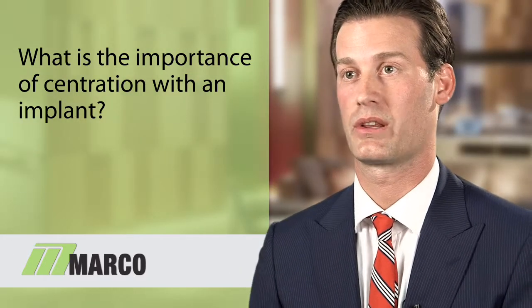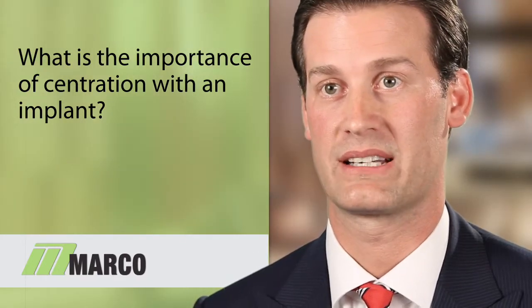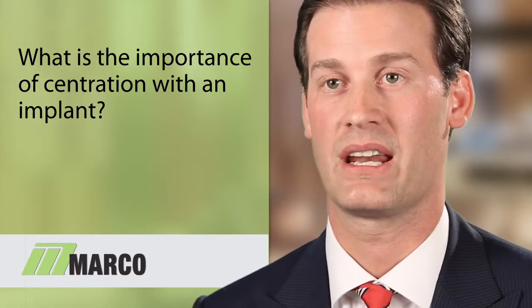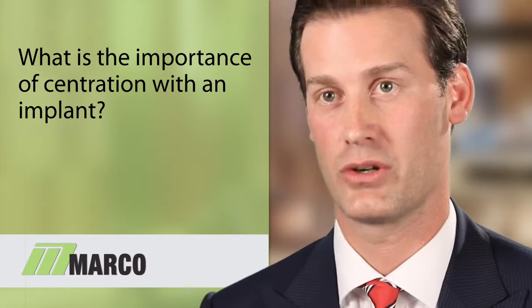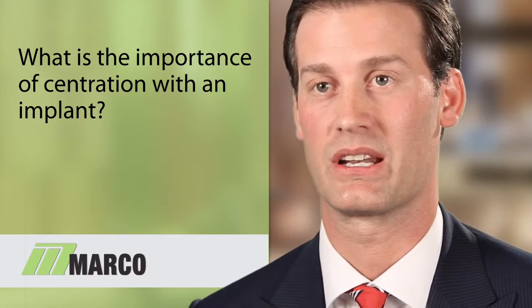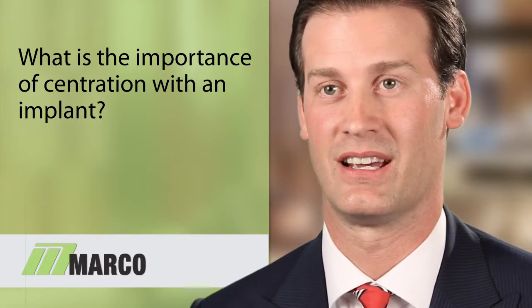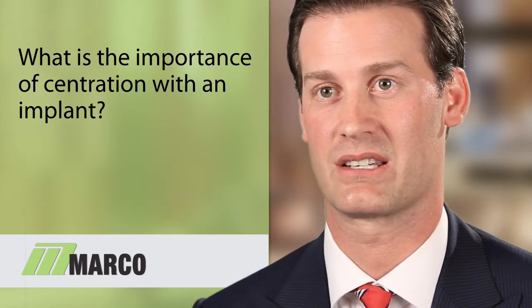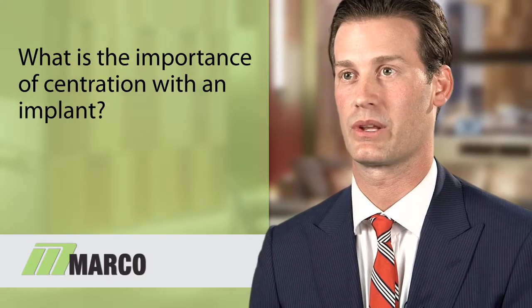Numbers such as 0.3 or greater of angle kappa are one way of identifying a patient, just as they enter the door, who may not necessarily be a very good candidate for multifocal implants. And if you choose to do an implant of that variety, I would certainly make a strong argument for paying a little extra special attention to how you address that individual at the time of surgery. And that is an imperative part of the surgical workup that in most instances can only be evaluated with the OPD-3.